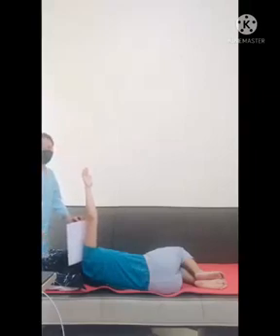So, the central ray in this projection is horizontal to the mid-coronal plane, passing through the mid-axillary region of the shoulder. So, the structure shown in this projection is the space of the shoulder joint.